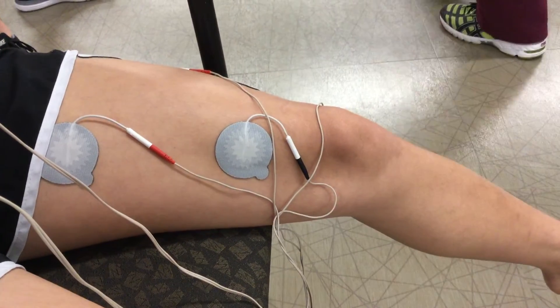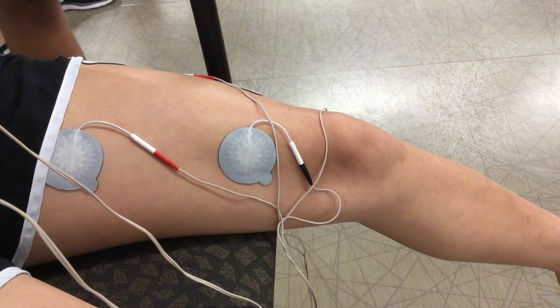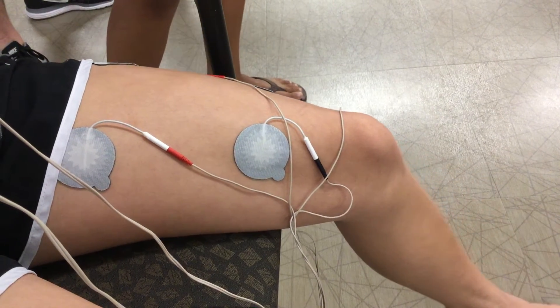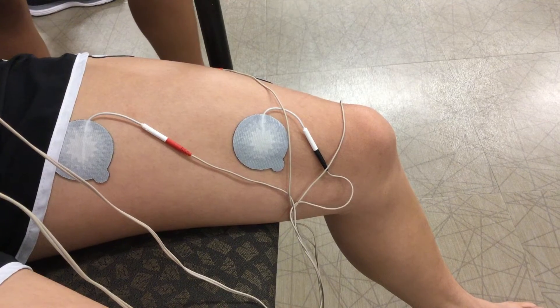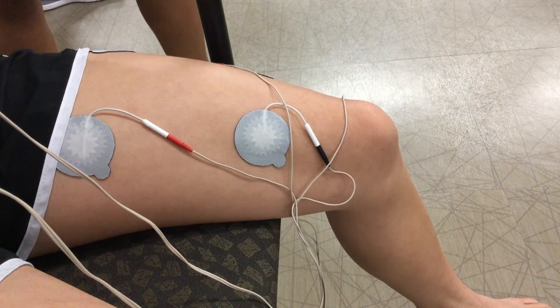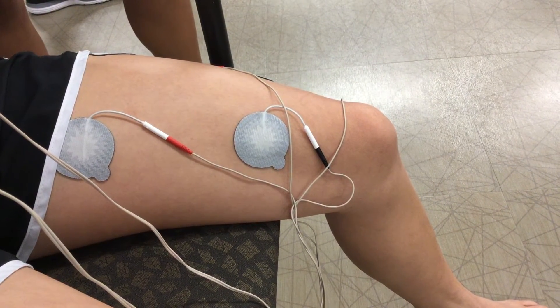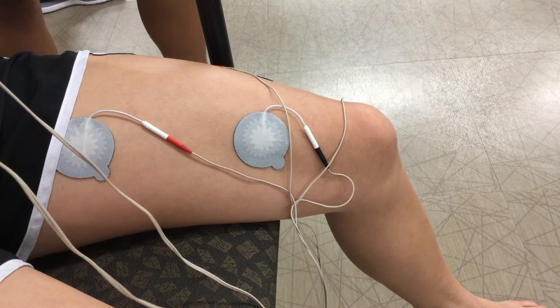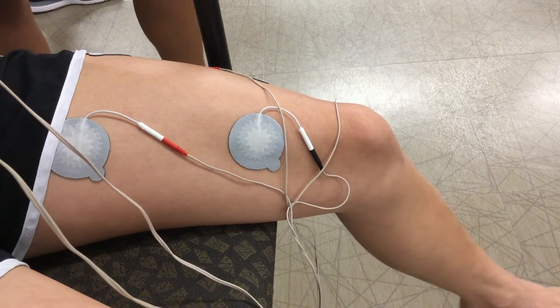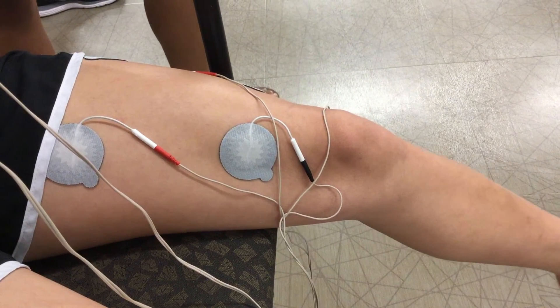Right there — so we have a contraction going on. As mentioned, it's based on how many repetitions you want to do, based on the exercise and strengthening, as if you were actually doing actual exercises. Can you go higher? Is it too uncomfortable? It is based on patient tolerance — we're using an NMES for the continuum right now.